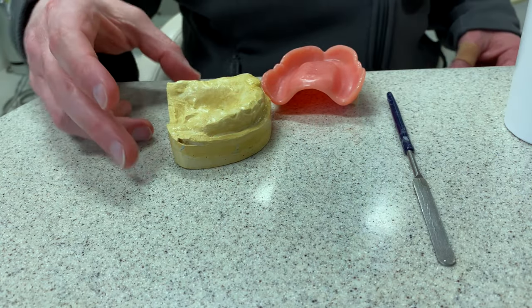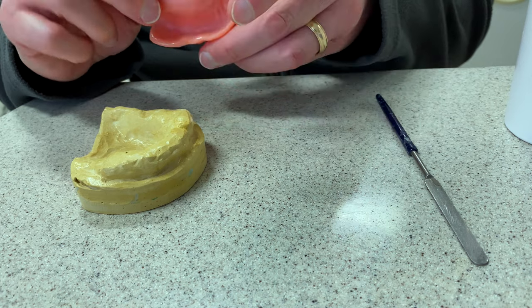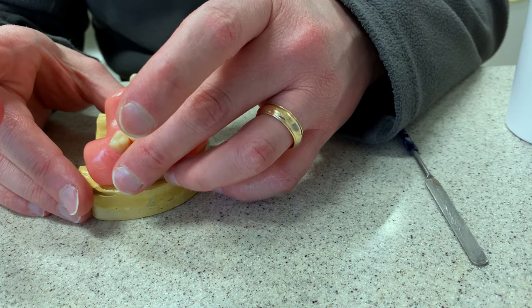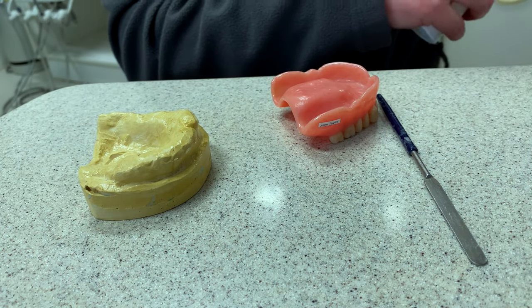Without further ado, I'm going to show you how this is done — how we make a soft denture liner work with the mouth. I'll be using a stone model. It's not going to be exact or perfect, but at least you'll get an idea of how the procedure should be done. The idea of a soft denture liner is to get the denture to fit better to a patient's mouth. So here we have a stone model — very generic, not the actual patient — and we have this denture. We have to mix the powder in an appropriate ratio with the liquid.